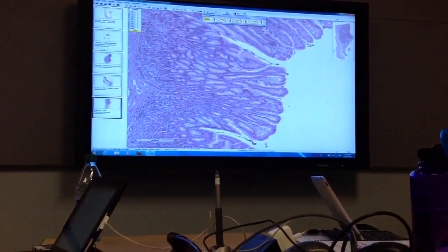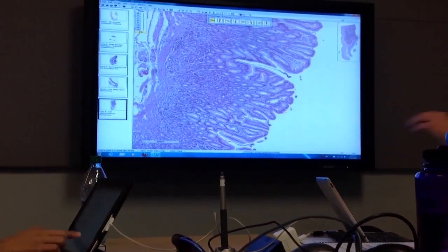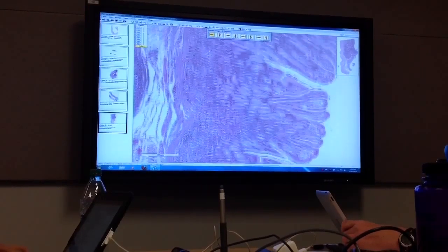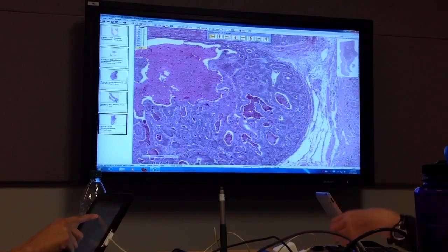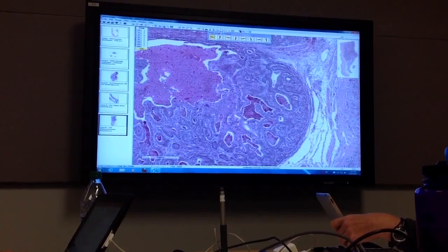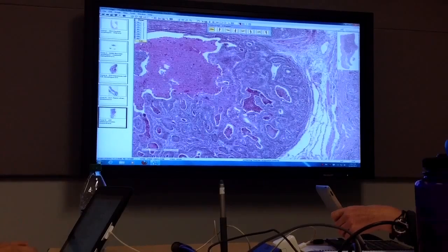Look like stomach? Yeah, good. So we're in the stomach. So we come along. Everything looks good. What is this down here? Right, exactly. So this is adenocarcinoma, and now again, this one is true adeno, but it has necrosis in the center.